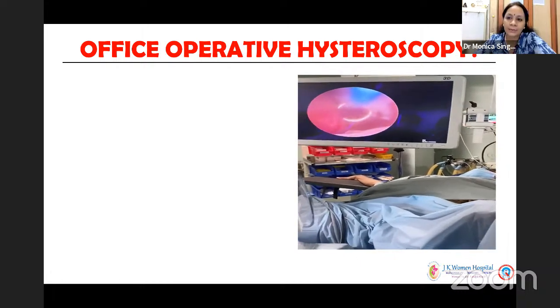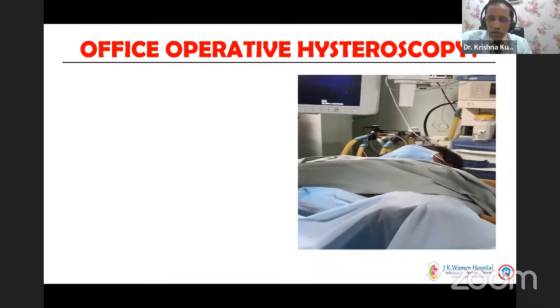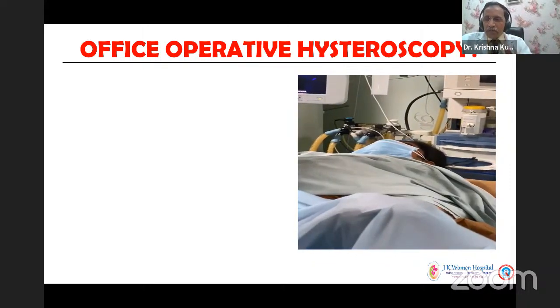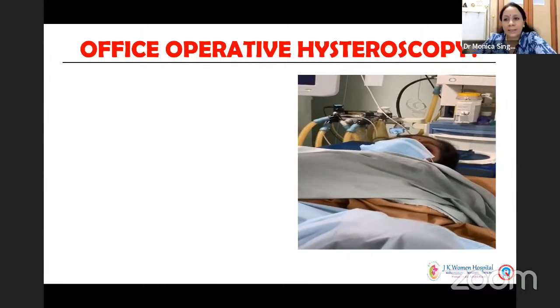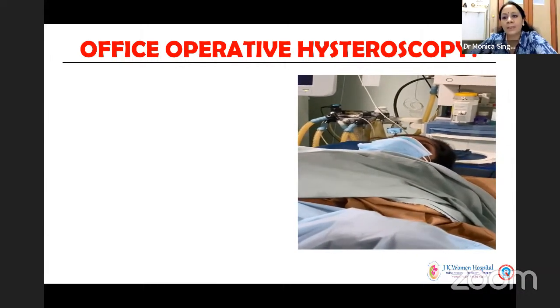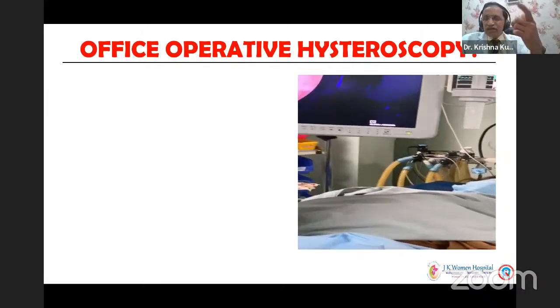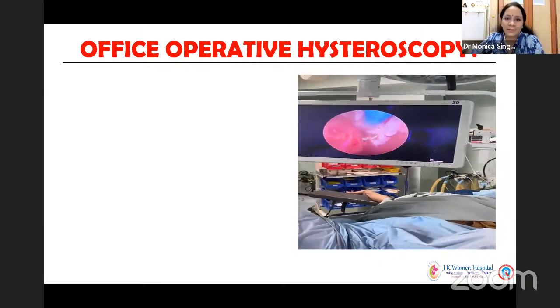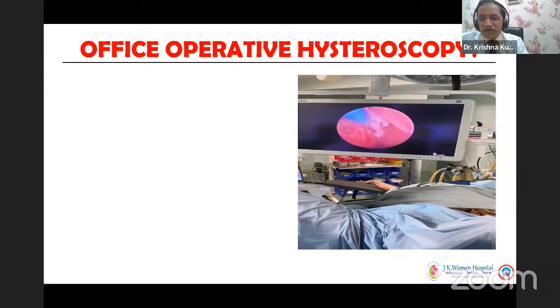The patient also feels it and the clinician also feels it. Second, you sometimes feel you may not do it in your office, but you can do it in your OR without anesthesia, like I do. There is a beautiful study by Dr. Clark in the UK. She is awake and I am using the resectoscope. Yes. So what are the challenges in India you think we face?